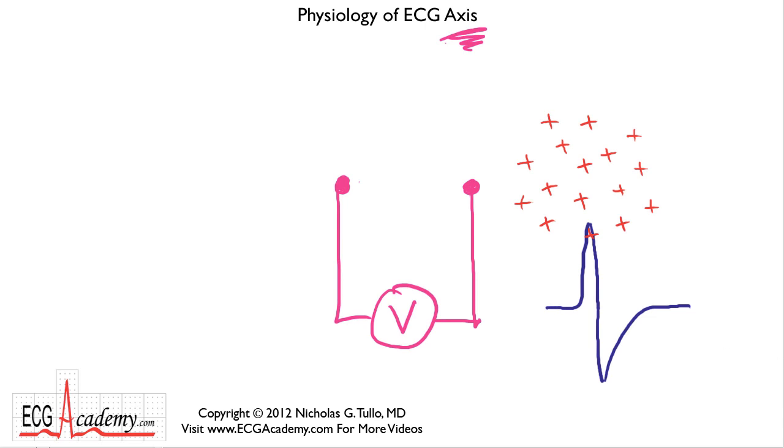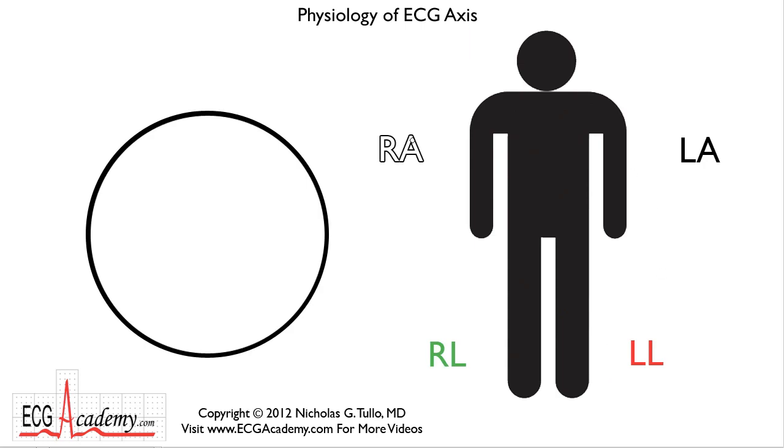So let's get to the real heart of the matter. Ha ha ha. Get it? Heart of the matter. The ECG machines record electrical signals from the limb leads and the precordial leads, which are the ones that we put on the chest wall. We'll cover these in a minute.